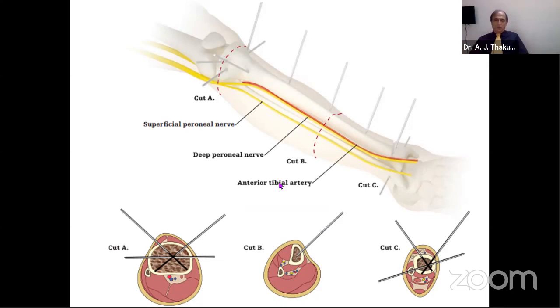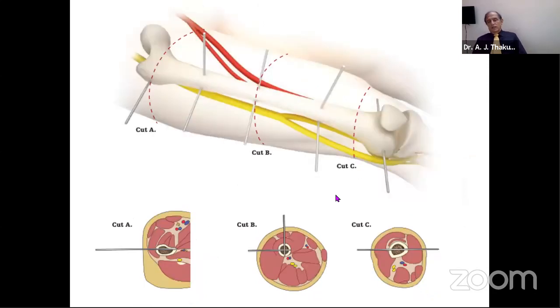Here is the tibia, which is showing the cross sections at different levels. Here there is a different configuration, but you get a wide range and then almost put it to 180 degrees. While in the middle section, you have got only 40, 50 degrees here. But lower down again, you get a larger one. So atlases are available for all limbs and to show the safe corridors, as they are called, through which you can pass the pins without causing any kind of damage. And they should be consulted before you undertake an external fixation.